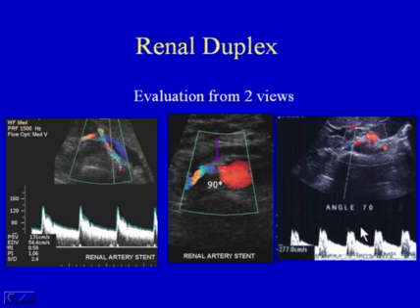If we come from the anterior approach, you can see the 90-degree course of the vessel from the aorta. Attempting to insonate that portion of the vessel does not give us very good Doppler angles, and in trying to measure this at 70 degrees, we end up with a peak systolic velocity of 277.